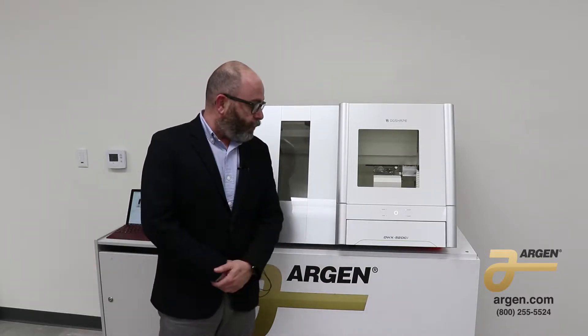Hi, I'm Evan Katz, Senior Education Manager for Argen Canada. I'd like to discuss with you the Roland DWX52 DCI.